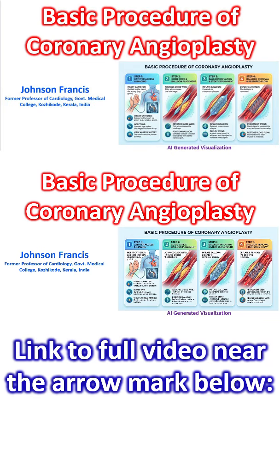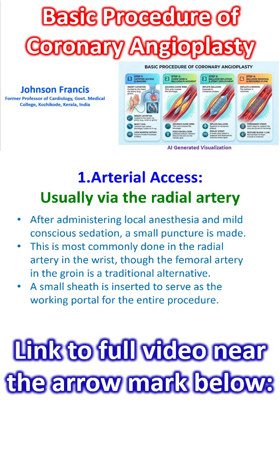Here is a step-by-step breakdown of a percutaneous coronary intervention, known as PCI or coronary angioplasty. It is used to remove major blocks in the coronary arteries, mostly for symptom relief, and is a life-saving procedure in situations like a heart attack.